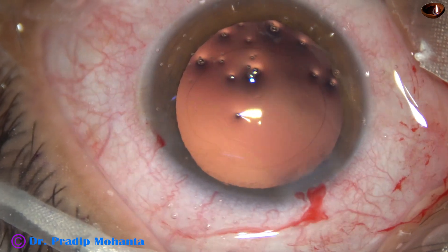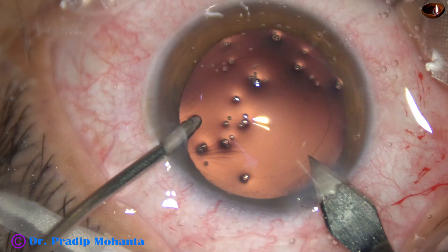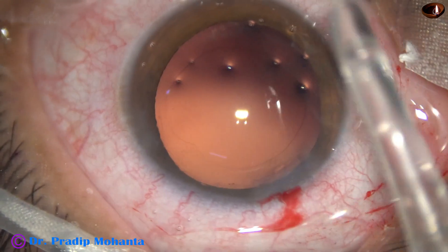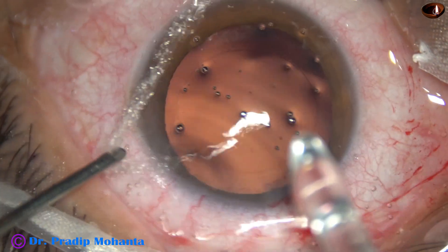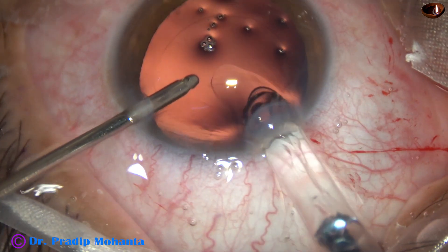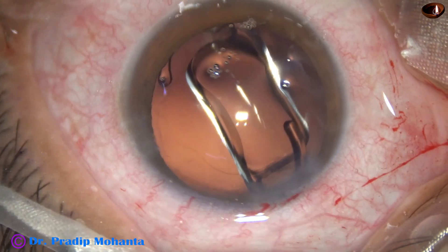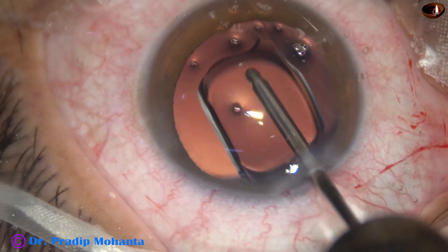Now is the time to implant an intraocular lens. I am using a beaver blade and enlarging the main wound to about three millimeters. Here goes the intraocular lens. This is eyhance from Johnson & Johnson. No financial interest, but all the patients are happy with this lens.